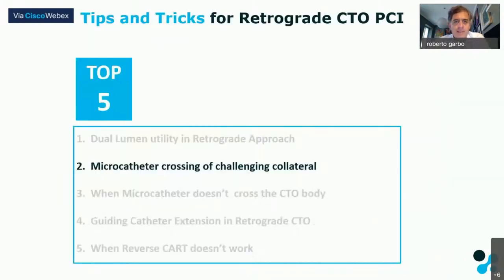Okay, so if you have some comments, Gabriele and Alessio, about this first session, please. Okay, just a quick consideration. The use of the dual lumen microcatheter during the retrograde approach is not so frequent. And I think that it's just for a very expert operator.